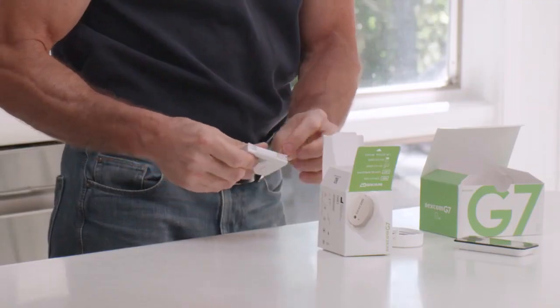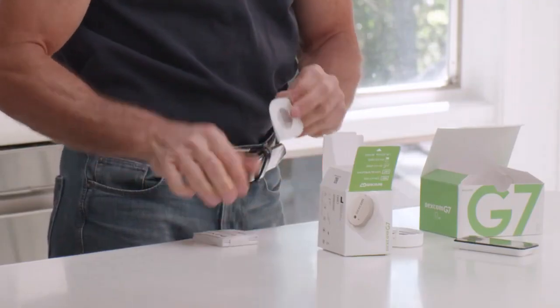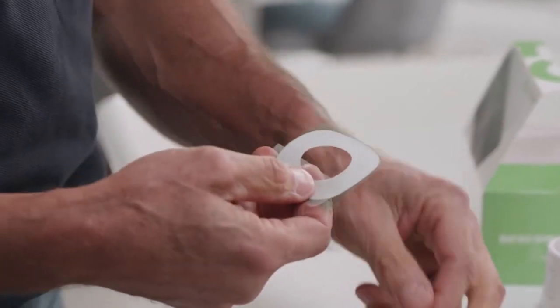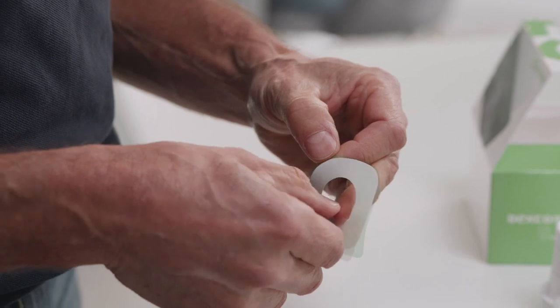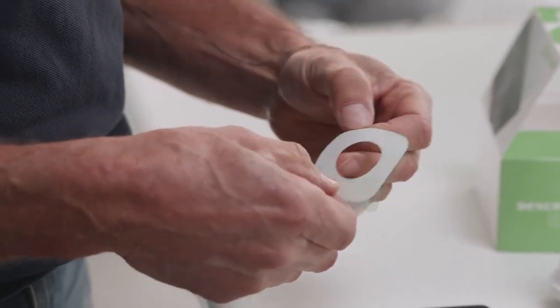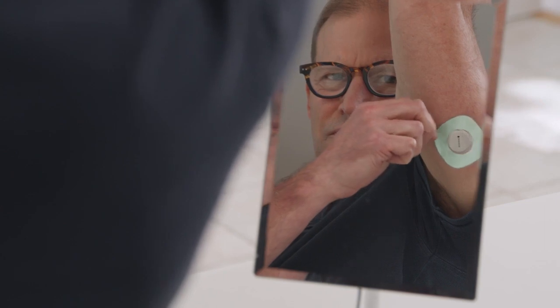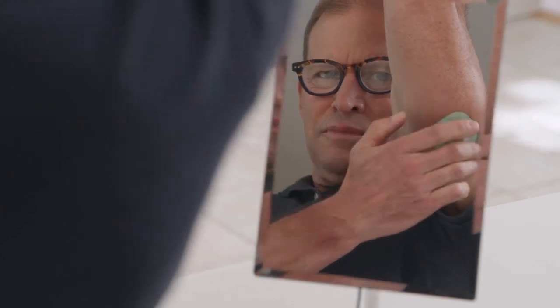Then press gently on the sensor for 10 seconds. Your overpatch will help you keep the sensor on and is bundled with your instructions in the box. Carefully pull off the clear liners one at a time. Don't touch the white adhesive area.